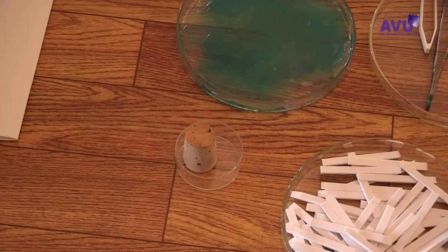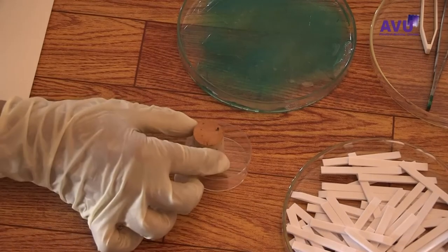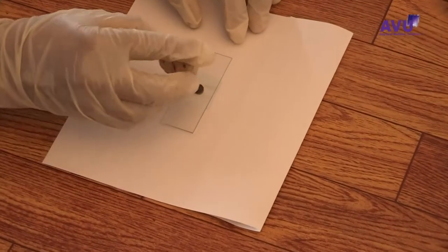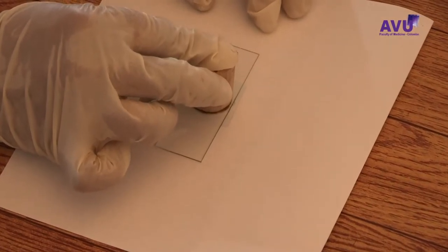Using the flat surface of a cork stopper, gently press on the cellophane strip until the faecal material gets spread evenly between the microscope slide and the cellophane strip.